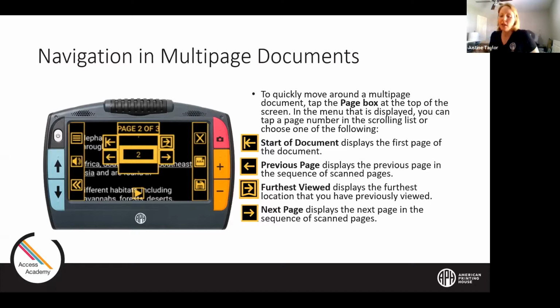I like how you can navigate it either landscape or portrait, so you can switch and orient the Juno any way, top, bottom, vertical, horizontal, whatever is the best way to get the best capture.